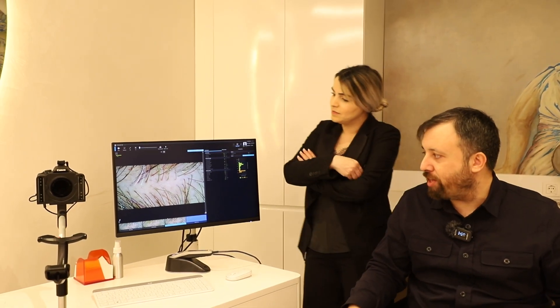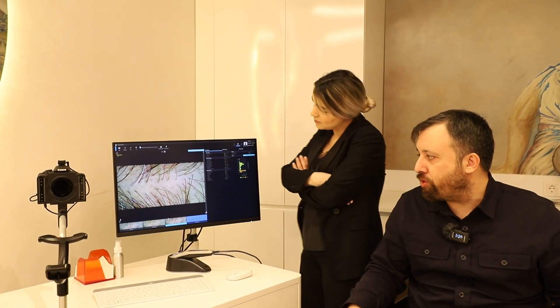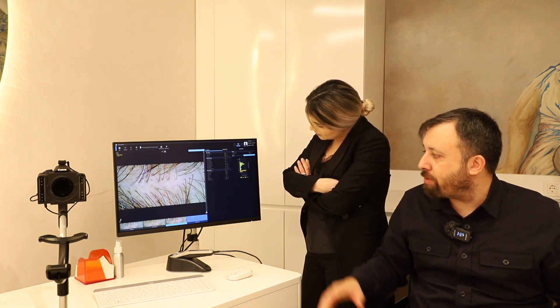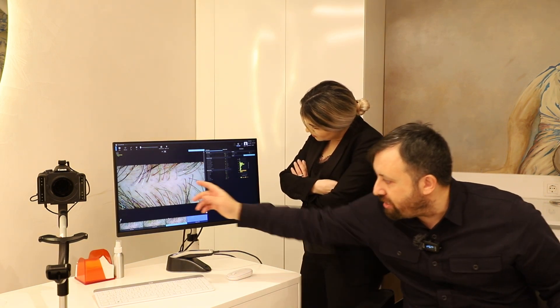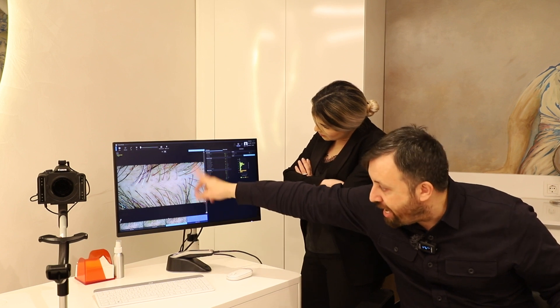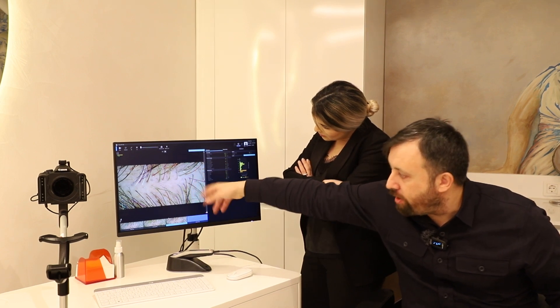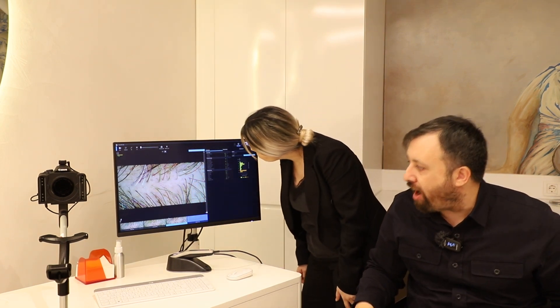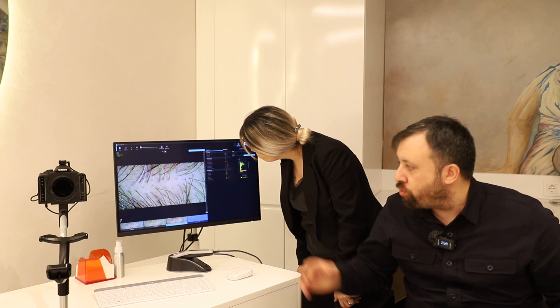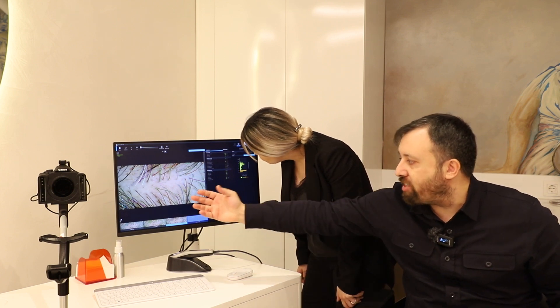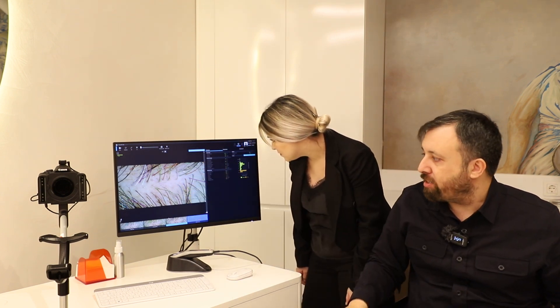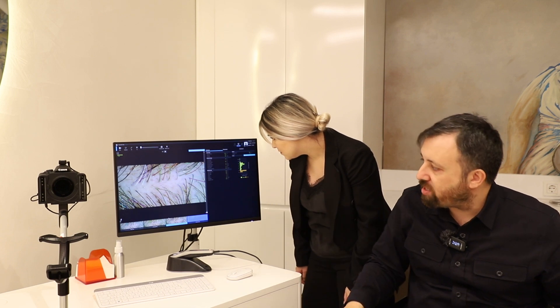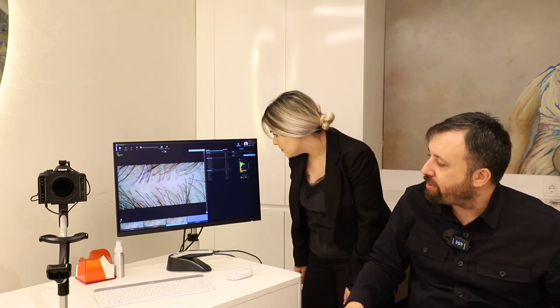Now it's possible to do this for every patient. As you can see with the tool, our expert can see the distance between the hair roots very well. She has a better idea of where to extract from and which points on the head not to touch.